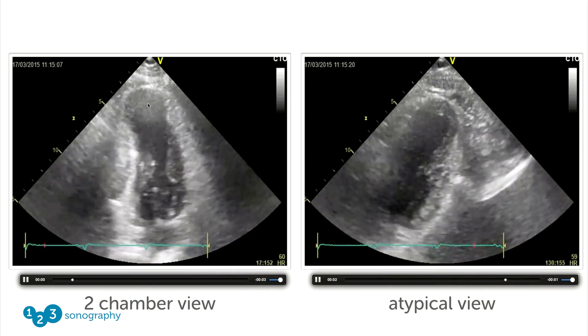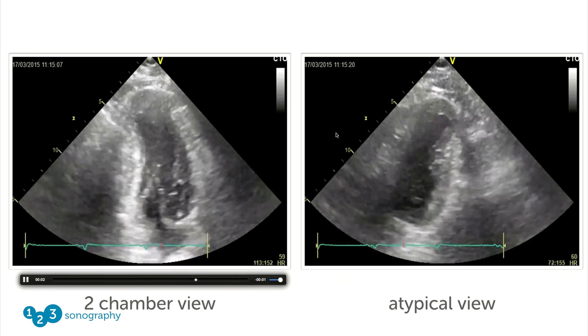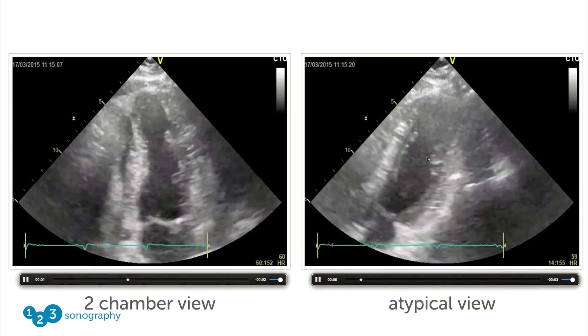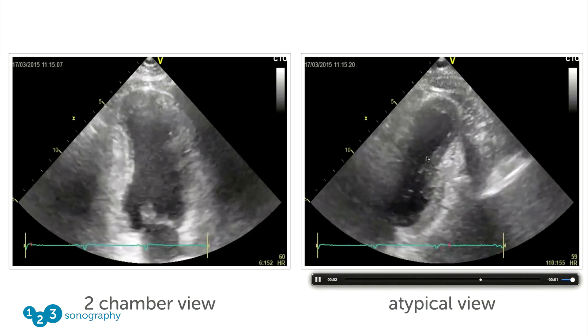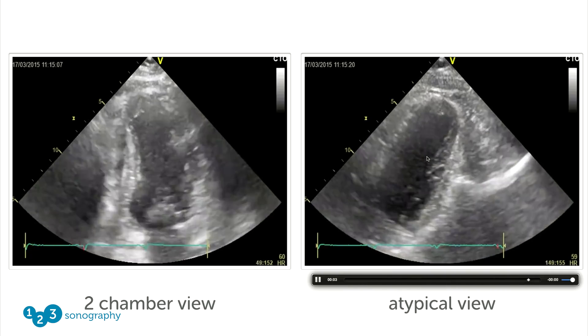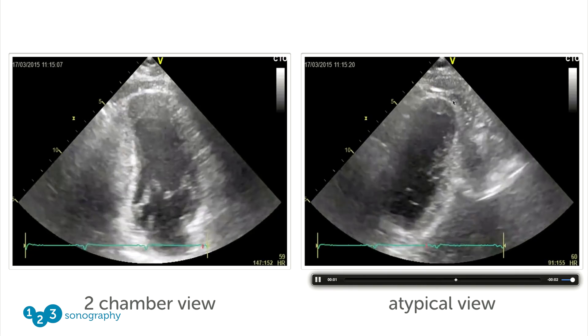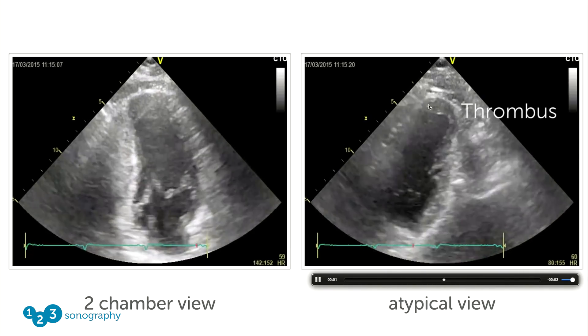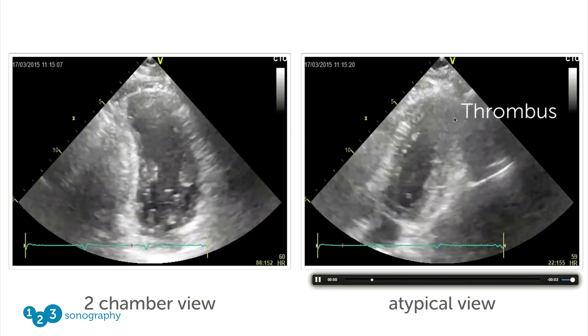But now back to our patient, Mr. Fanconi, and the images that Scott is now recording. A two-chamber view — remember we can see more of the apex here — this is the thrombus. And here is another atypical view. Scott is imaging from a very medial position, pointing the transducer down towards the apex and looking at the very apical parts of the myocardium. Right here is the thrombus, which is relatively fixed and probably has a relatively low likelihood of embolizing.